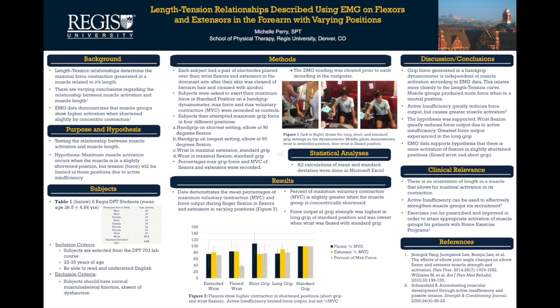Hello, my name is Michelle Perry, and today I will be talking about our findings looking at length-tension relationships in the wrist flexors and extensors using electromyography, or EMG, data.